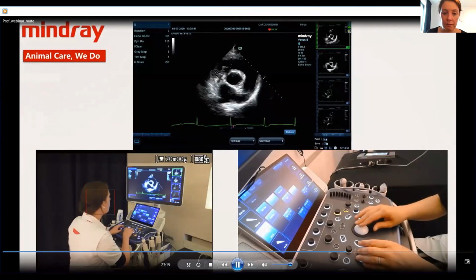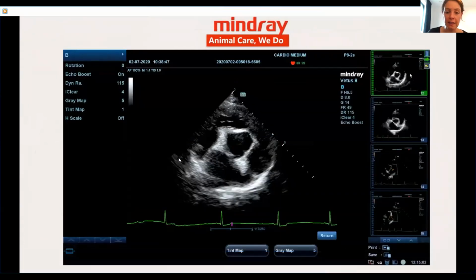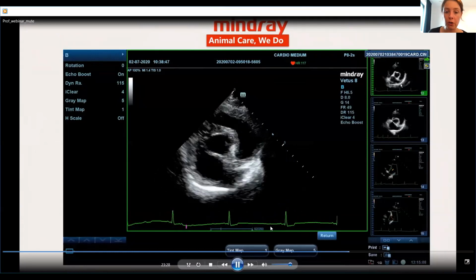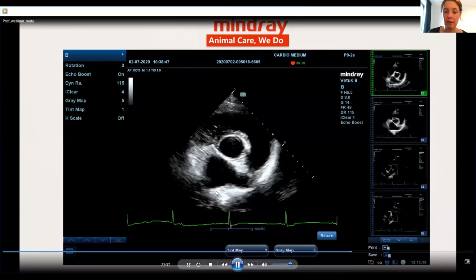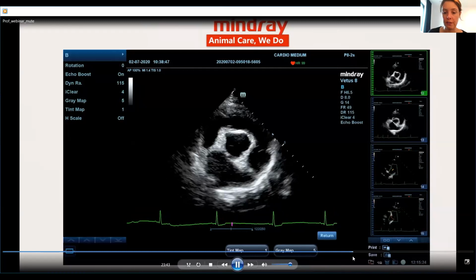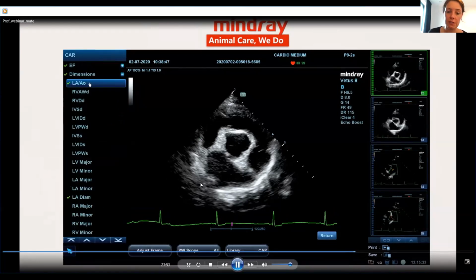Okay, then what I'm doing here is I'm actually measuring left atrial size, and that can be a bit challenging to find a good view, a good cycle where you can get a good delineation of the atrium, where you don't have too much disturbance of the pulmonary vein coming in here, and where you get a good view of the aorta. So I'm actually looking for a good place to measure. This is not super because it's a bit unclear here, but okay. It's a real life situation, so we will have to do it with that.